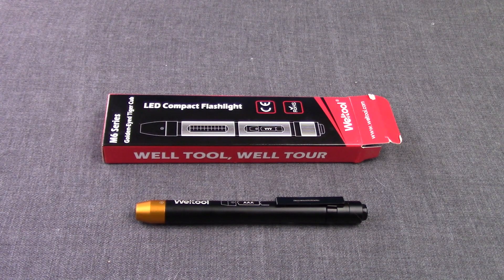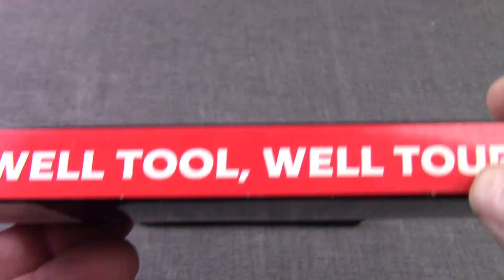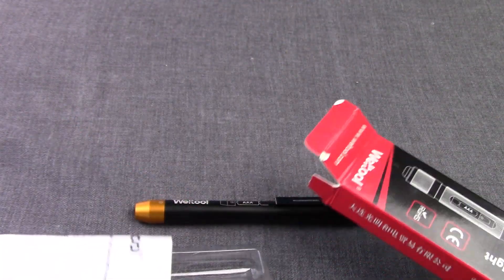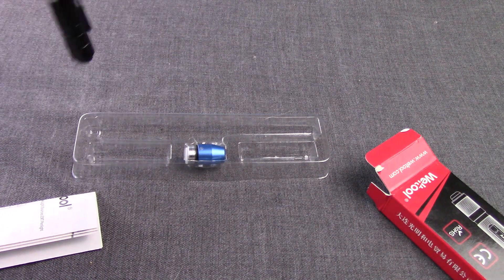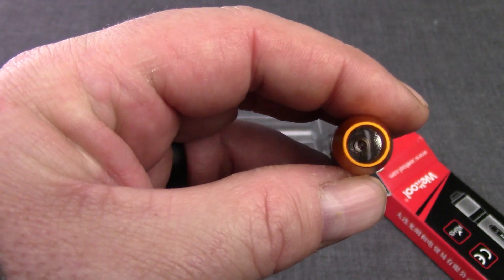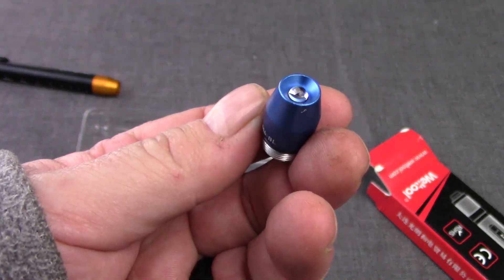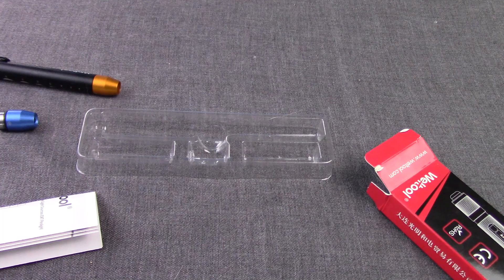The Weltool is a very peculiar light. Here's what you get with the packaging — it has some model numbers on the back, 'Well Tool' and 'Well Tour,' which is kind of their motto. What makes this light so interesting is the fact that it comes with two heads. You'll see a gold head, which is a xenon with a reflector. You also get an LED head with a standard type LED.